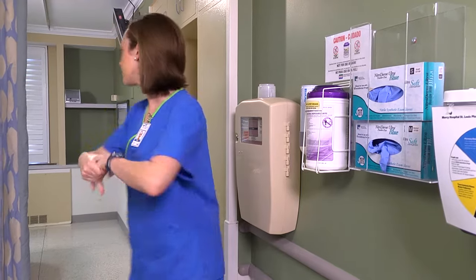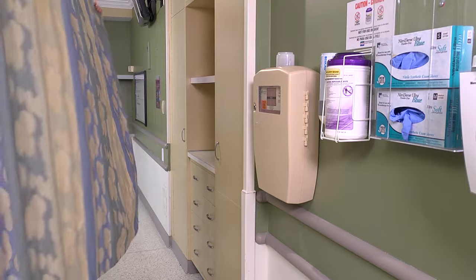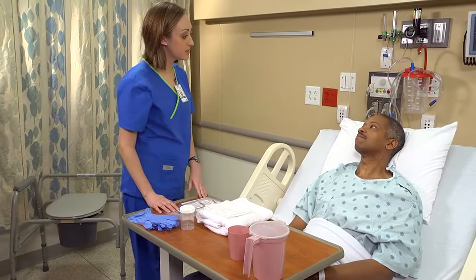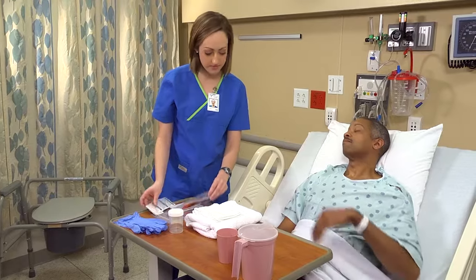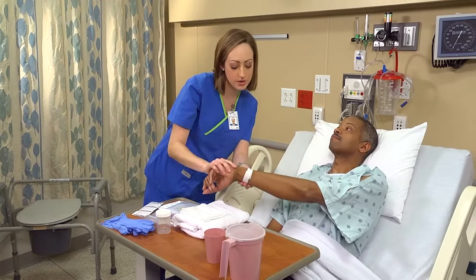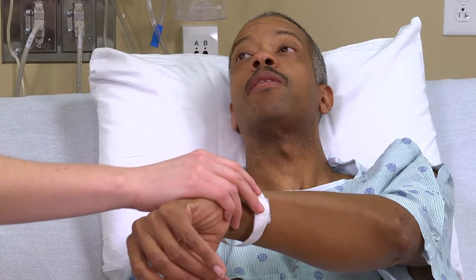After performing hand hygiene and ensuring privacy, introduce yourself to the patient. Then identify him using two identifiers and confirm patient information on the requisition form. Ask the patient to tell you his name and date of birth. Raymond Williams, 10362.